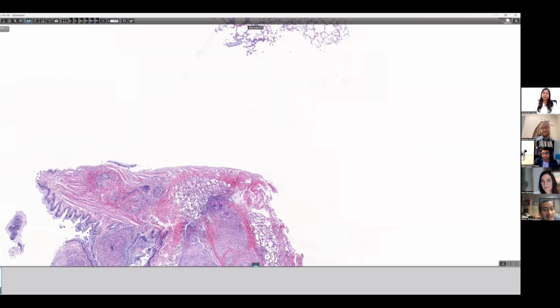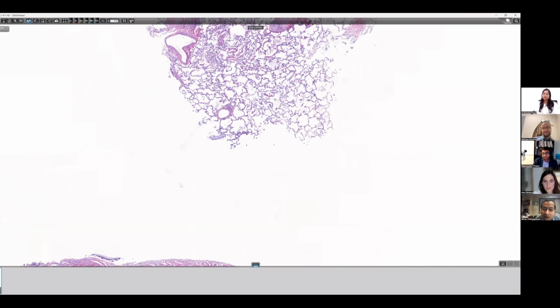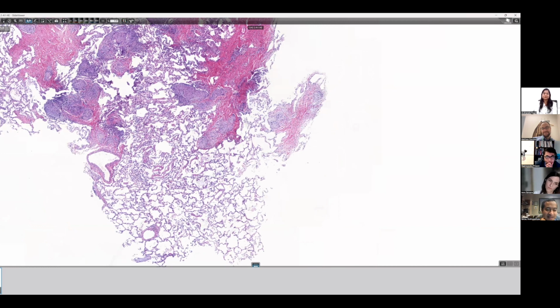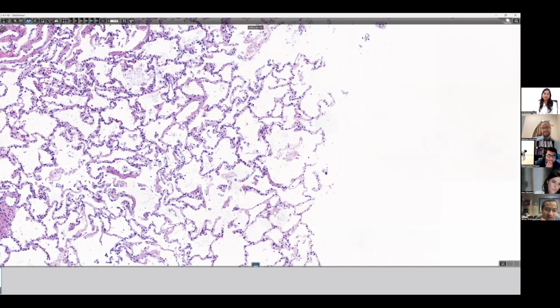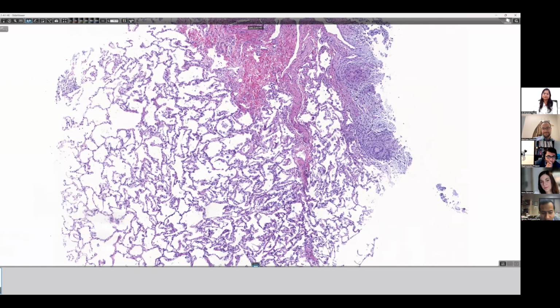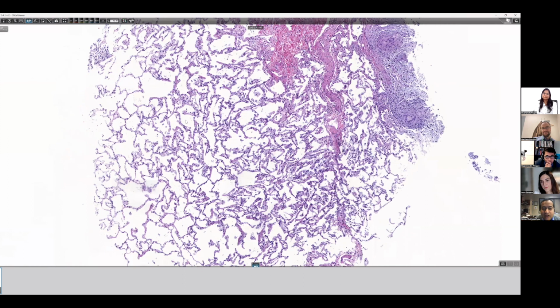One thing that is for sarcoidosis here is that when you look at the lung away, this kind of lung is completely normal, which does not make sense for hypersensitivity pneumonitis. So even if they think it is hypersensitivity, I would say, look, pathologically, it's not. It makes no sense to not have a lymphocytosis in the interstitium away from it. And like everybody else mentioned, the granulomas are completely wrong for hypersensitivity.